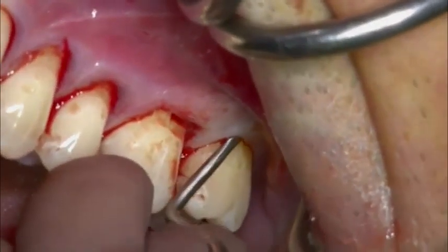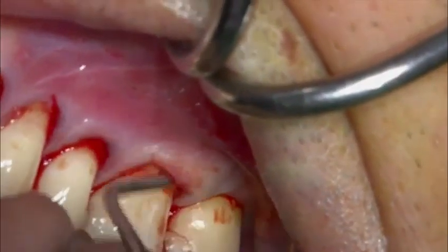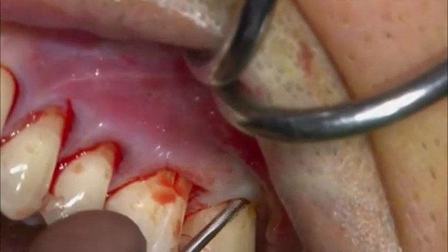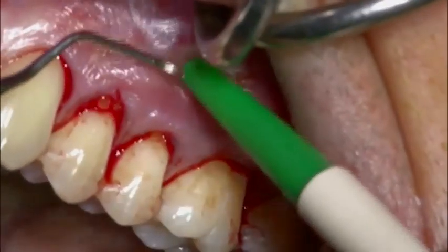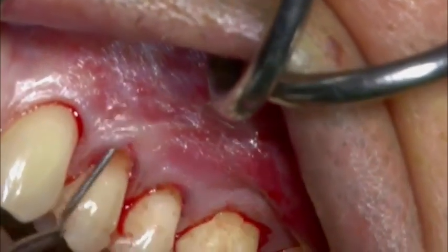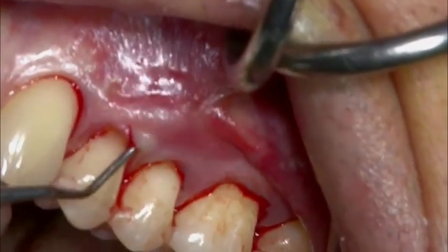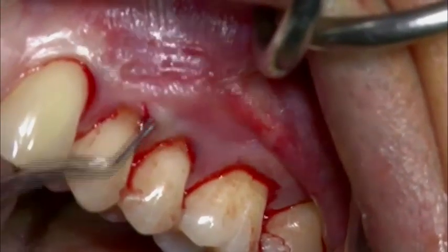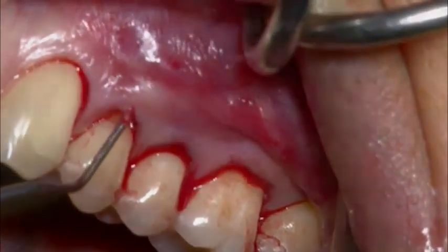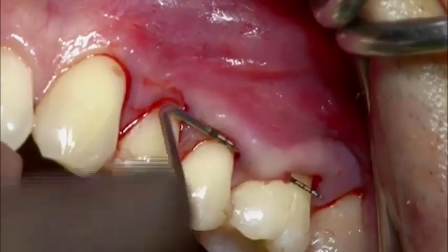A Gracey curette is used to mobilize and extend the pouch to avoid any tension in the subsequent coronal advancement. Transversal sounding of the tunnel is performed without detaching the papillae peaks.